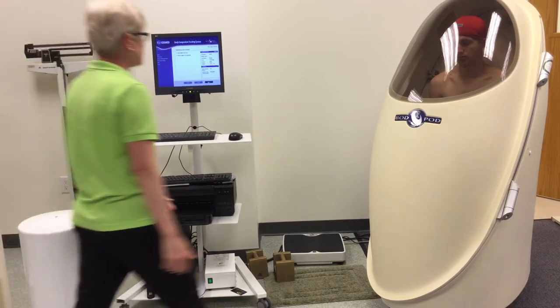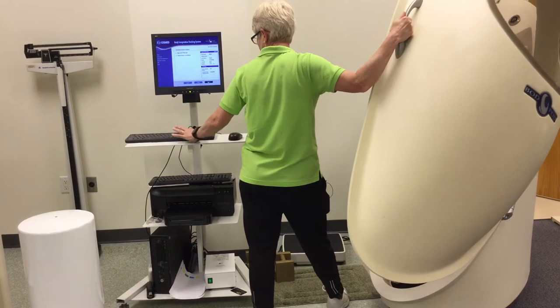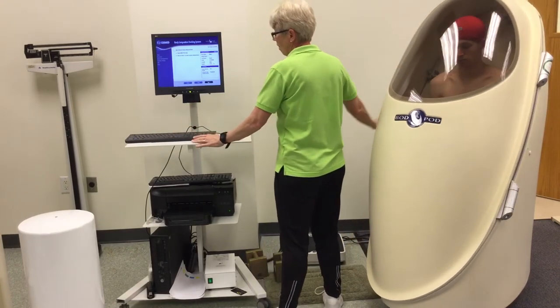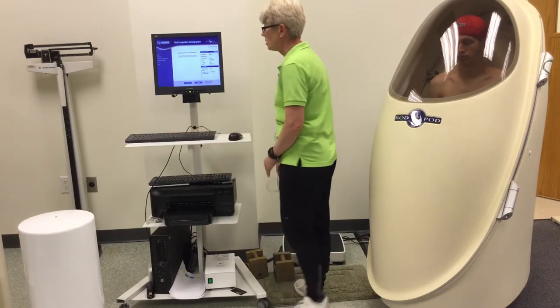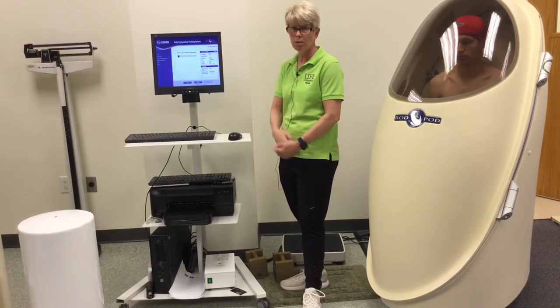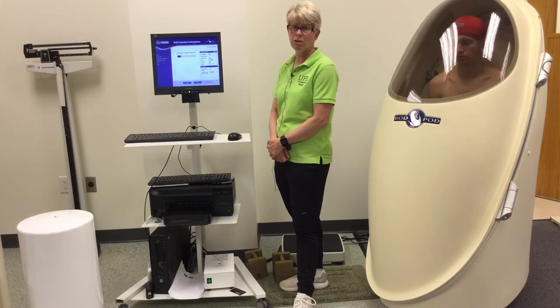That volume pass was completed. Now it's going to ask me to open the door, and now we're going to close it again. You don't want to be touching any of the outside of the bod pod, and you hit next. It's going to make another pass on his volume — anywhere from two to three passes — to make sure that the system is measuring accurately.